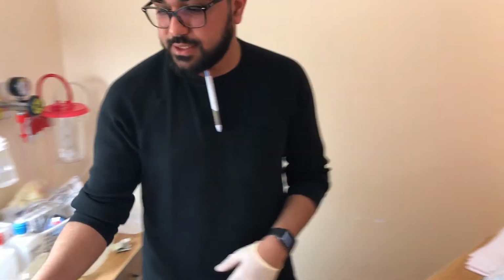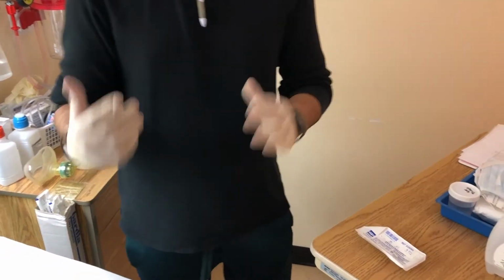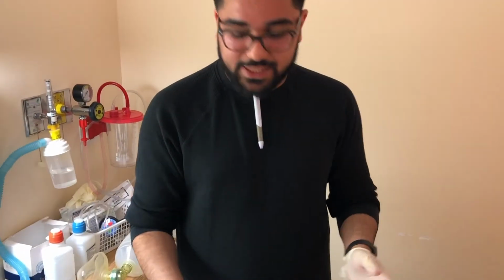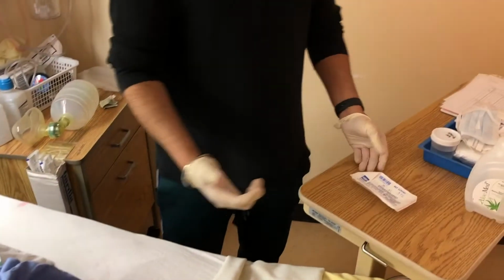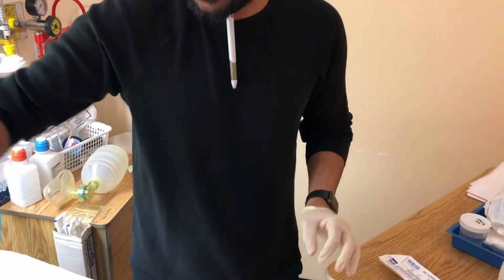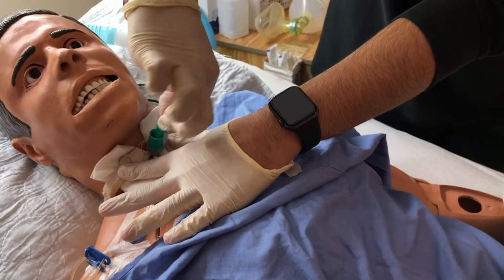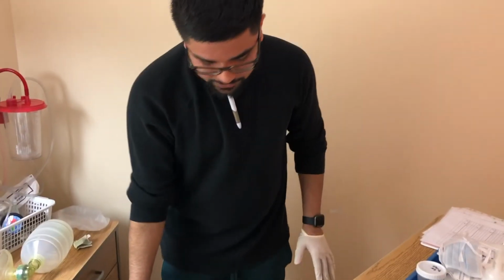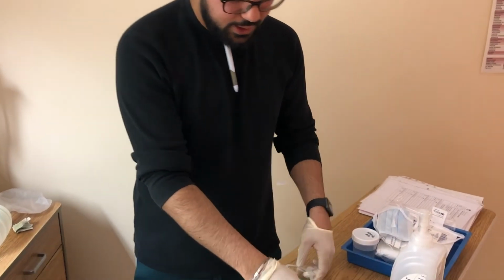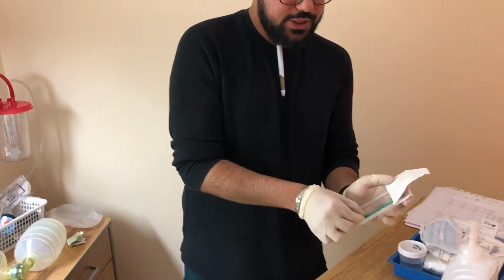Okay. So we measured the cuff pressure, and now what we want to do is change the inner cannula. I'm going to do it by clean technique. What we want to do in this case is take this one out and open this one up using sterile technique and only touch the rim portion. So what we could do is take this out like this, stabilizing here, pulling out as such, and this would be discarded. Then we would throw that in the garbage, which I have underneath me.